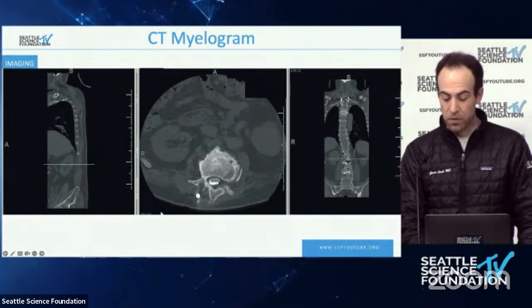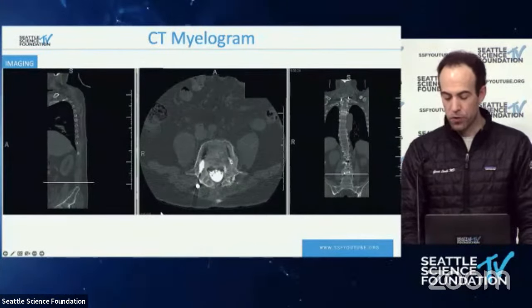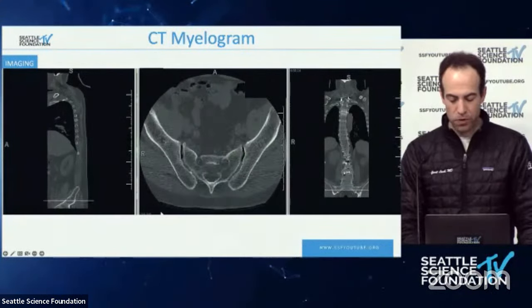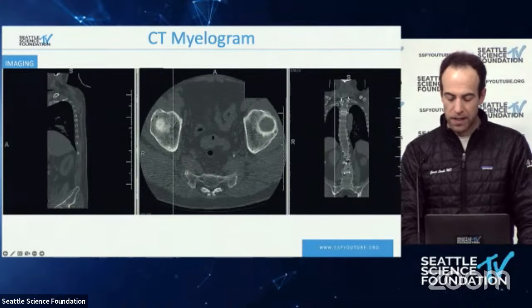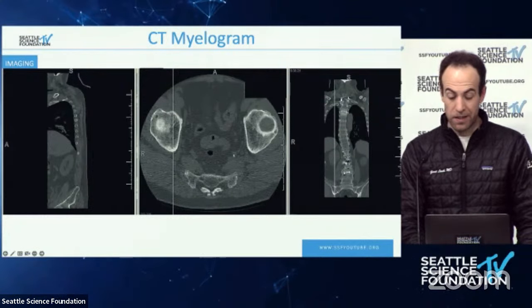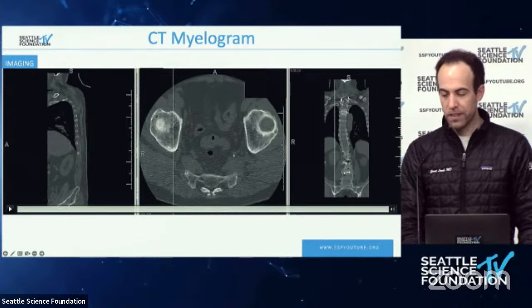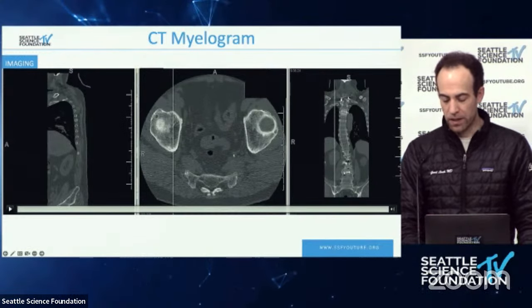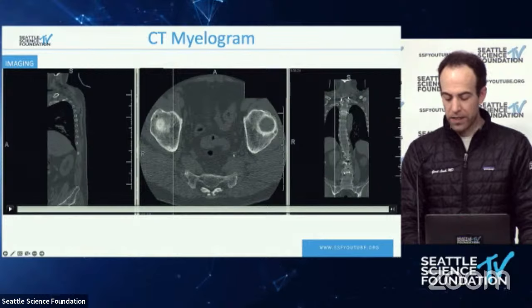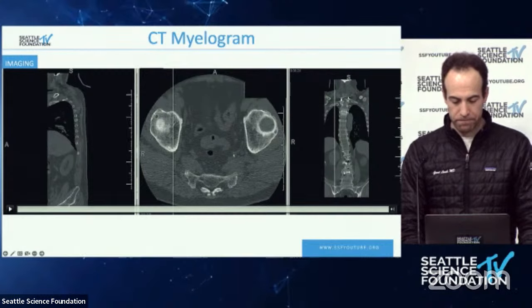And finally, in the lumbar spine, we see an incomplete interbody posterior bony fusion at the level of L1-L2, also with loosening of the pedicle screw at this level, and also a symptomatic impingement at the level of the cauda equina. Moreover, as we already see here, especially in the sagittal images, we have a severe kyphotic deformity with 25 degrees between T4 and L1, lumbar lordosis minus 20 degrees, pelvic tilt of 50 degrees, pelvic incidence of 61 degrees, which significantly progressed compared to his previous images.